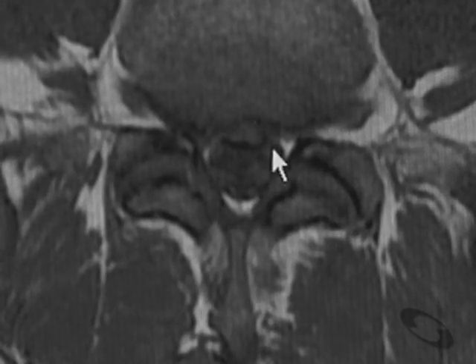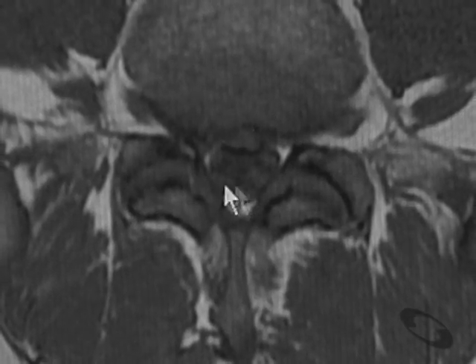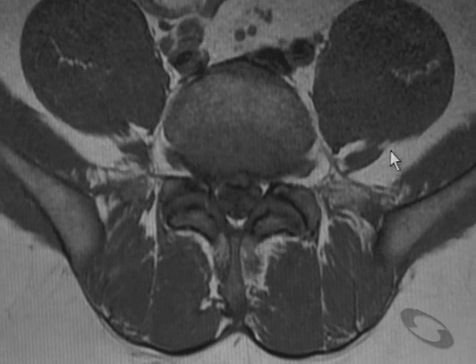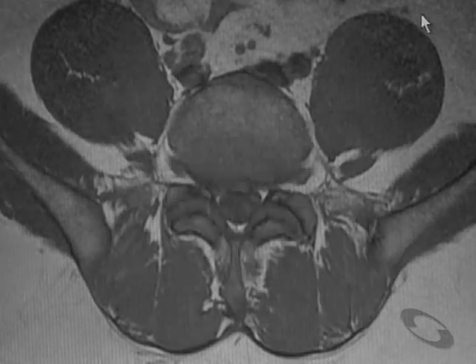This is the thecal sac. This is the left L5 nerve root that's already exited. This is the right L5 nerve root. This is the psoas muscle, the iliac artery, iliac vein on the left, iliac vein and iliac artery on the right. Our approach for the anterior interbody fusion is going to be from the left.